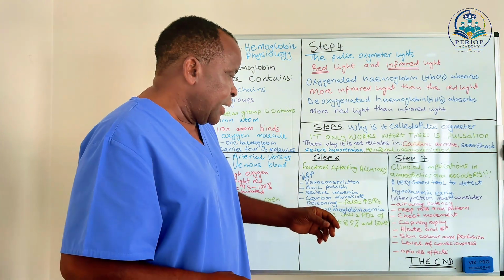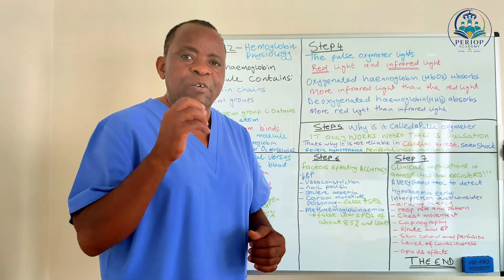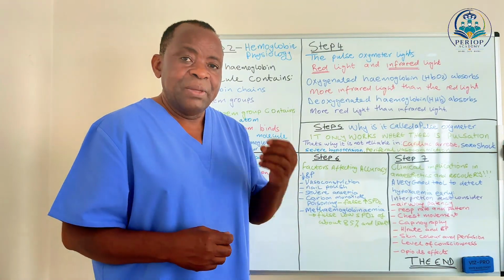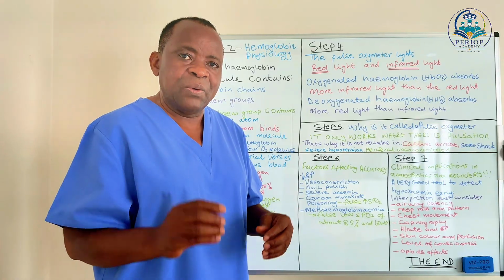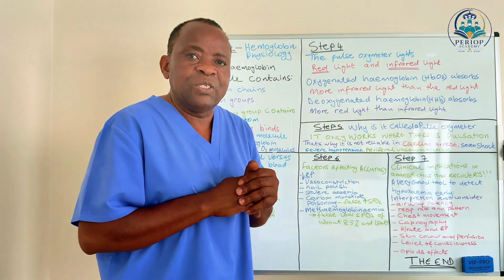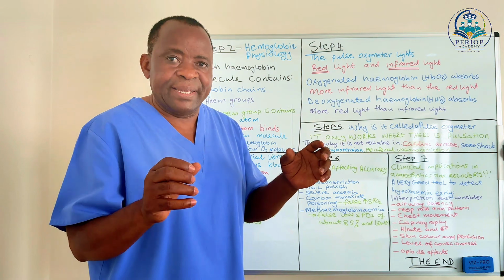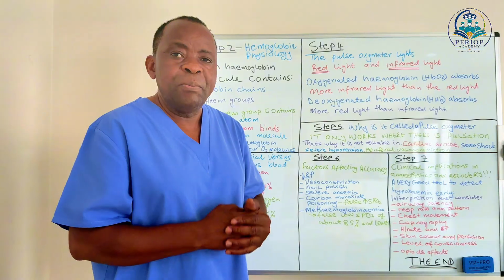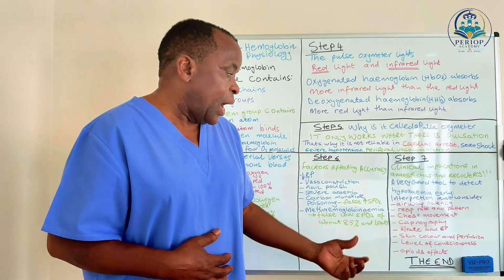And then the rest, the heart rate and blood pressure. The lower the blood pressure, the more likely it is that you have low oxygen saturation, for the same reasons we discussed before: vasoconstriction, vascular collapse, and blood being rediverted elsewhere. If it is vasoconstriction because of temperature, we want to know why the patient has hypothermia. We address it by warming up the patient, by making sure the patient is fairly comfortable, to get the good results.